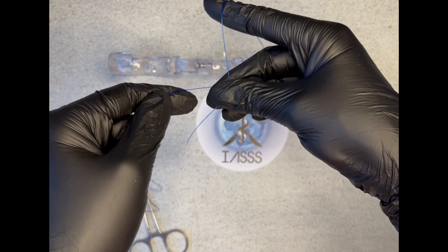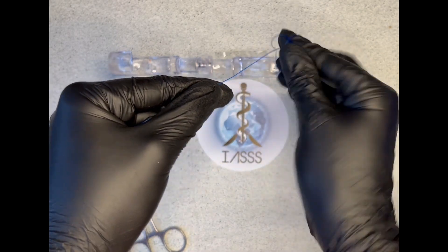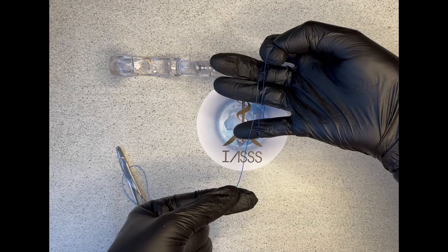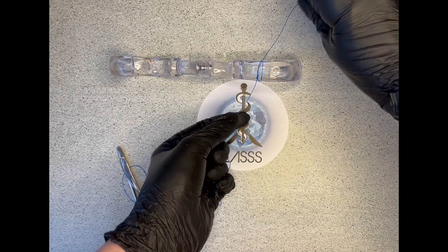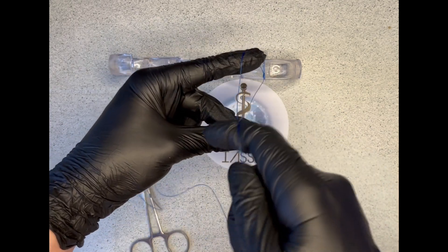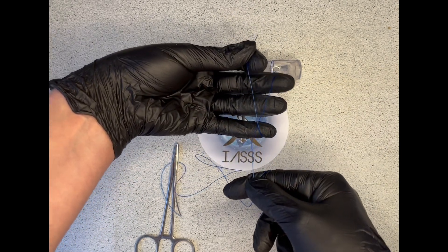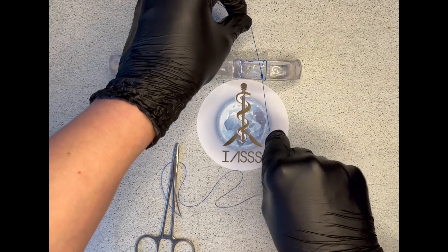Now with the nylon between my middle finger and index finger extended, I've created a four. I'm going to wrap the index finger around, pull it through and guide it down with my hand onto the tissue. Now flip over the hand, lay it down — middle finger goes over the outside under the inside — and guide it down with the finger to secure it nicely into a reef knot. For the left hand: suture between your middle finger and thumb, extend your index finger, wrap around, pull through, pull it towards yourself, guide it down. Flip over your left hand, two pieces lie parallel, middle finger goes over the outside under the inside, and you pull it away from yourself and guide it down with your index finger to secure the knot. So that's the hand tie.